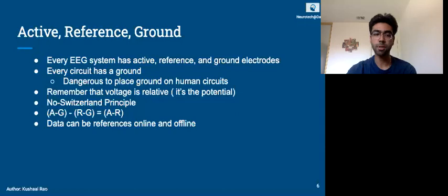And the idea for a reference point is that we want to pick a point. It doesn't really matter where in this case, because no point is completely electrically neutral. But there are certain tips for choosing a good reference point. Conventionally in an ERP system, we usually use the mastoids, which are the bony parts right behind your ear right here.